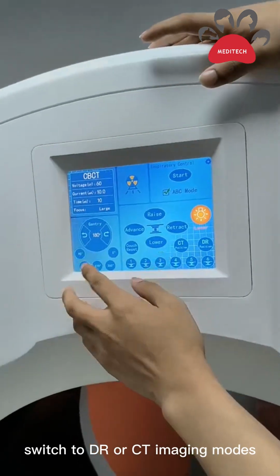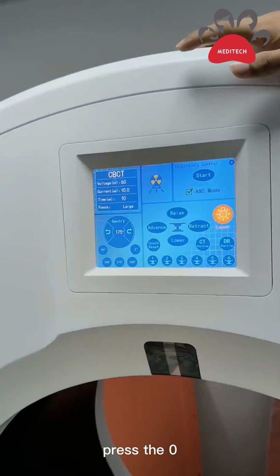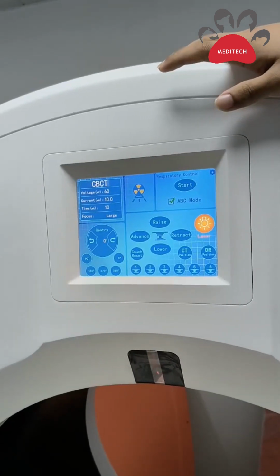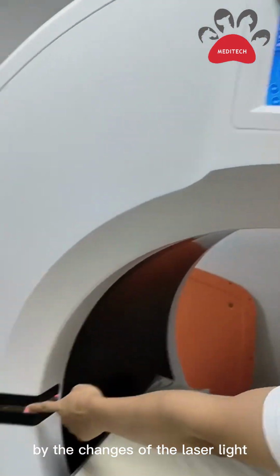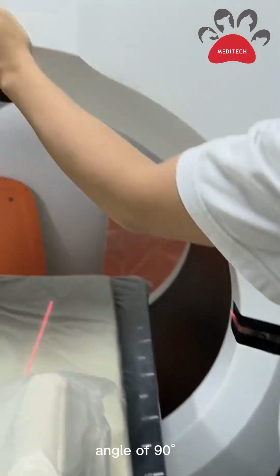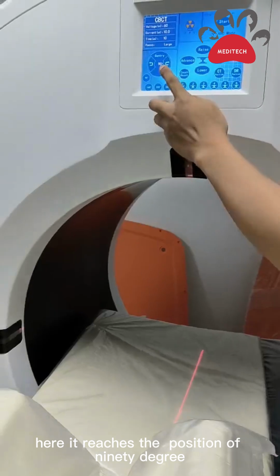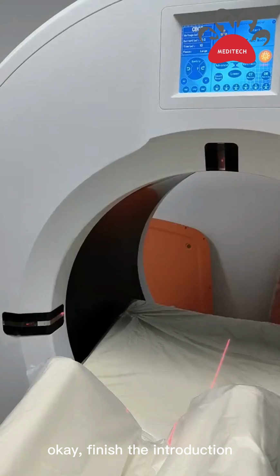OK, to switch to DR or CT imaging modes, you need to reset the gantry. Press the 0. The gantry resets back automatically. Also, we can see the change of angle by the changes of the laser light. Angle of 90 degrees. See the laser light. Here it reaches the position of 90 degrees. Press 0 to reset back. OK, finish the introduction.